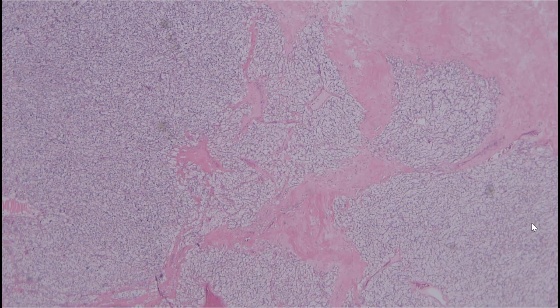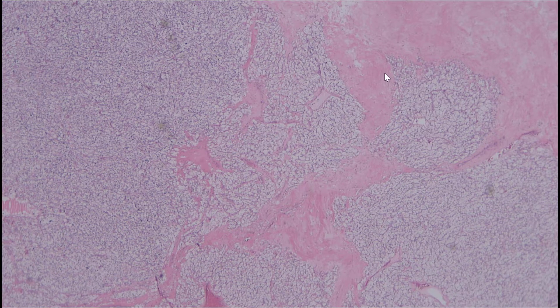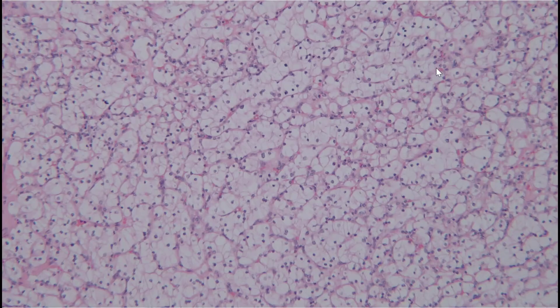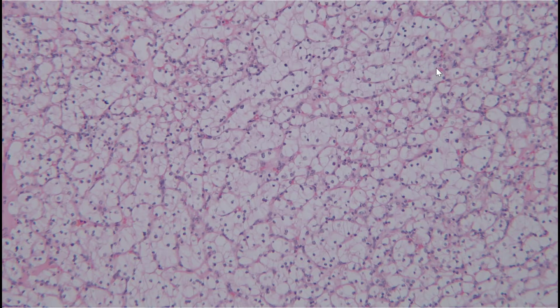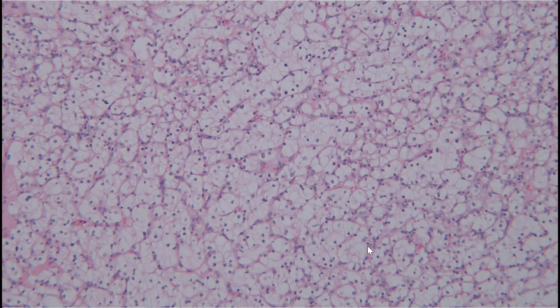From low power, you'll notice a lobulated or multi-nested type of growth pattern set within fibrous tissue representing a capsule. On the 10x objective, the most striking feature is an epithelioid, cohesive neoplasm with abundant, optically clear cytoplasm. There is also a delicate capillary network running around the tumor cells — all important clues.